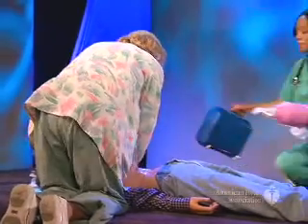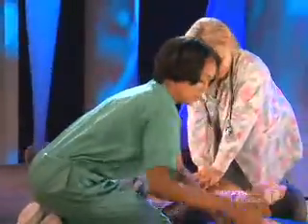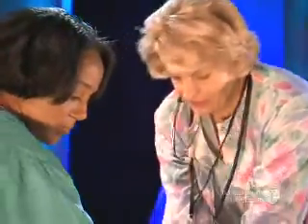When the AED arrives, put it near the rescuer who will be operating the AED, and turn it on. Some AEDs turn on when you lift the cover. Others have a power button. Apply pads to patient's bare chest.